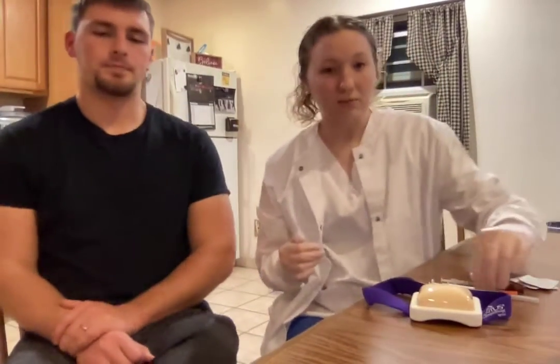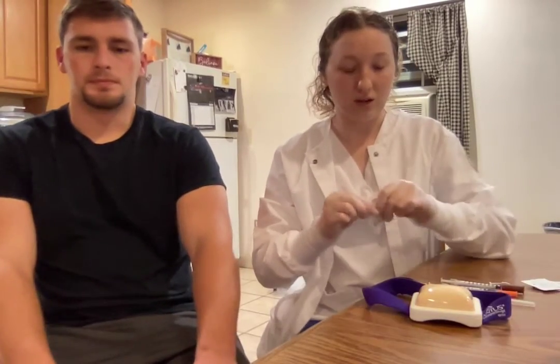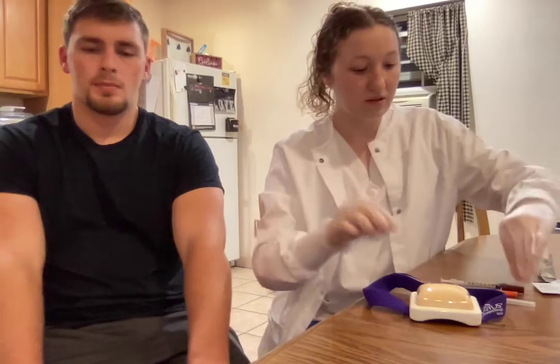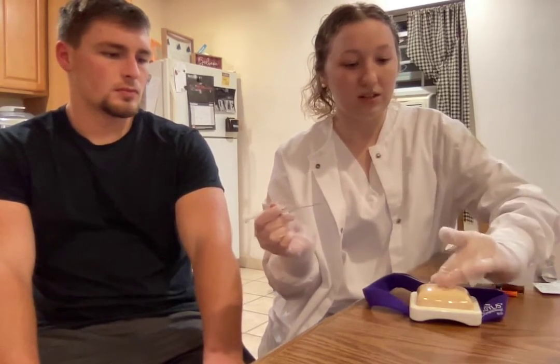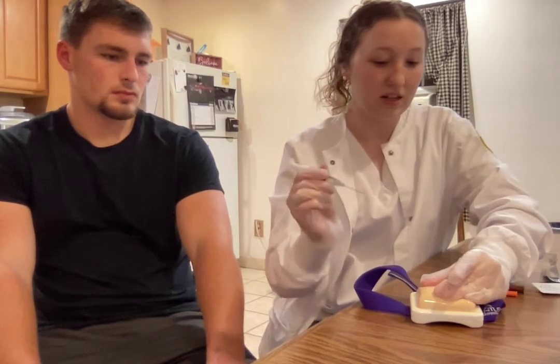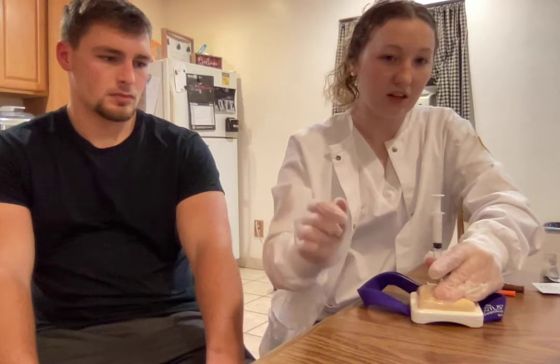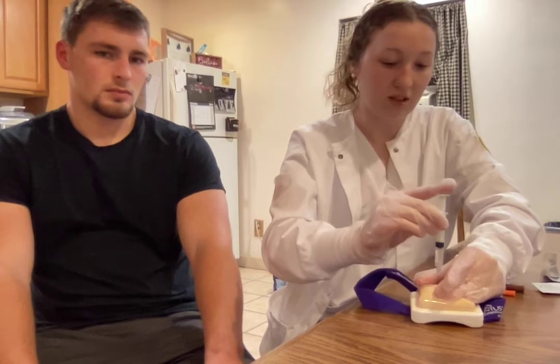So to do an intramuscular injection, you can also use Z-Track method, which I will be using today. So you're just going to take your alcohol prep pad and wipe their skin off. And then for the Z-Track method, you're just going to take your 3 fingers and you're going to pull the skin back to create traction. And then you're going to take your needle at 90 degrees and insert. And then I'm going to hold it with these 2 fingers and I'm going to aspirate to make sure I don't get any blood. And then I didn't, so I'm just going to inject.